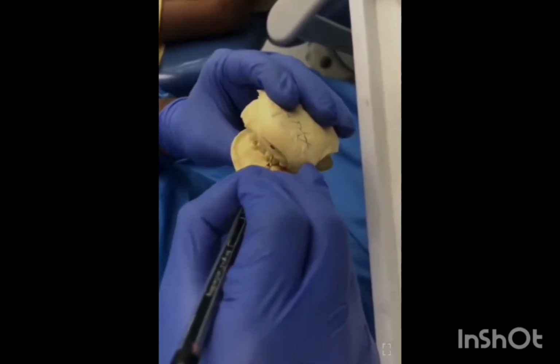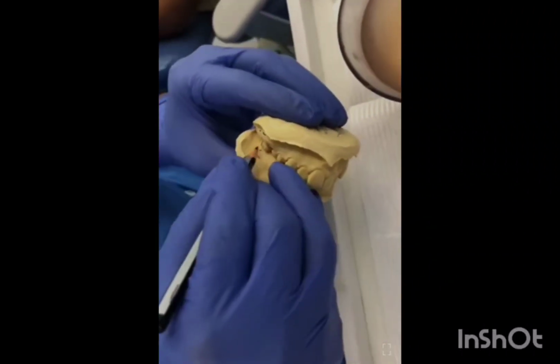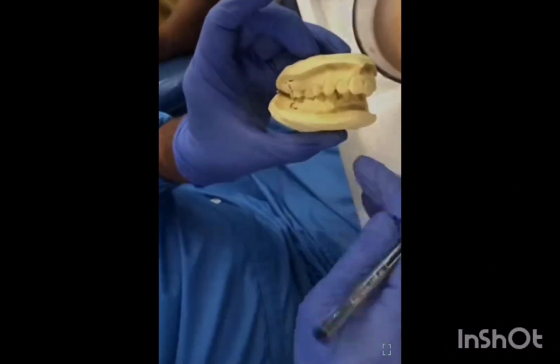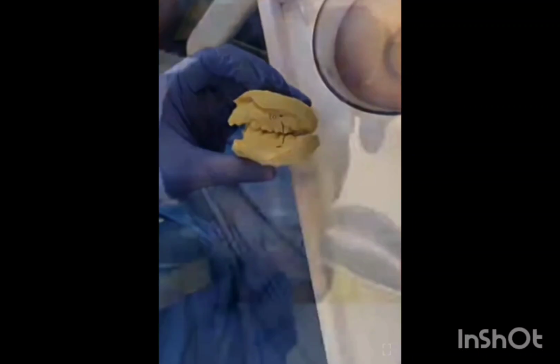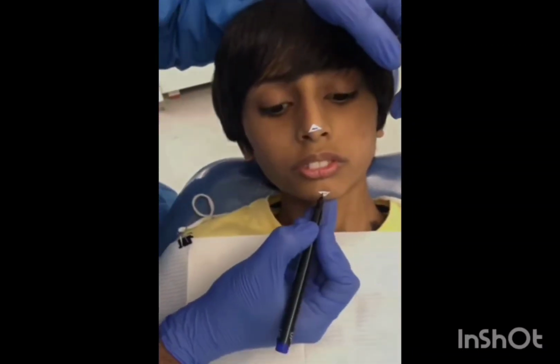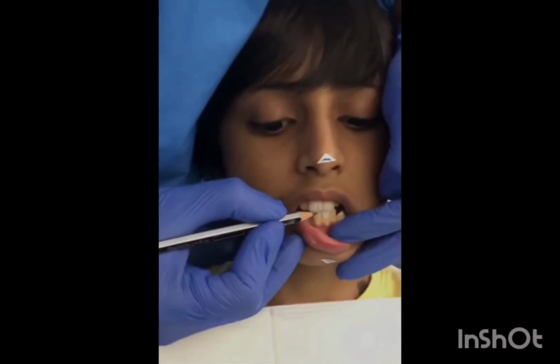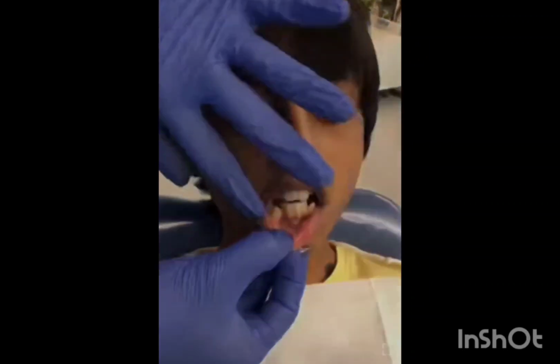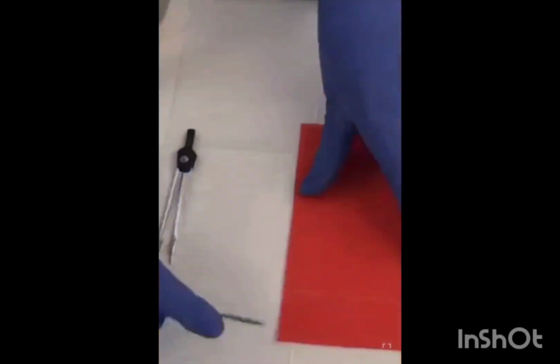See, for bite registration, we will first mark points on both sides of the cast. This is the amount of vertical opening that we require and plan. We measure it. Now we take two reference points, mostly the tip of the nose and a point on the chin. He is drawing the midline. So the midline should coincide while doing bite registration, right?